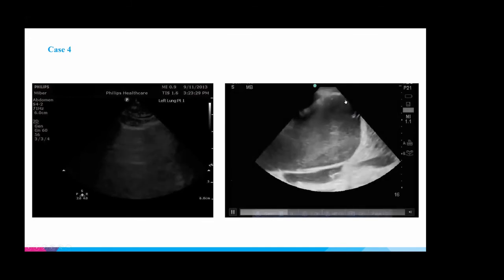Yeah, so the main thing here is trying to identify any structures that we can. So I would just point to the fact that this curvilinear structure that you're seeing here is the diaphragm, right? And then this here is probably intra-abdominal, so probably seeing the tip of the spleen here. So that means all of this is something that's there where lungs should be there. And this is not classic of a typical simple effusion, right?